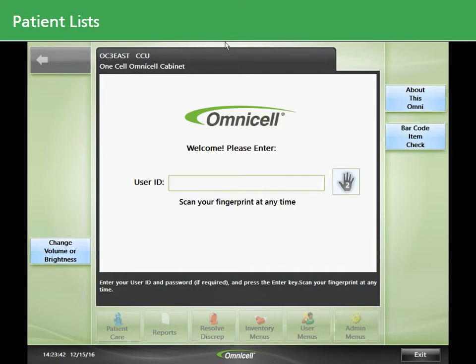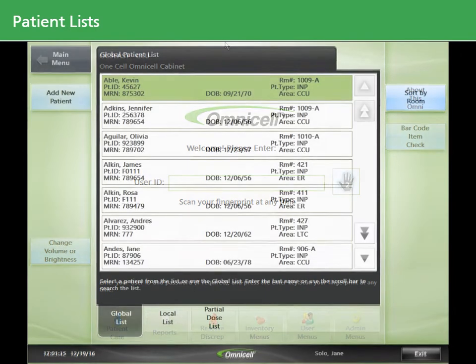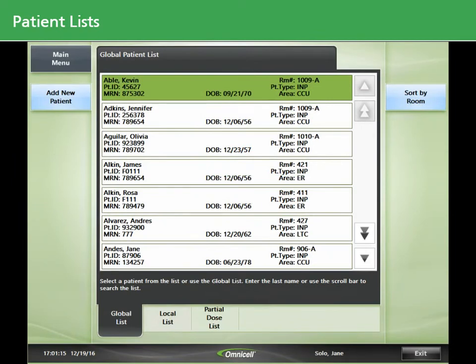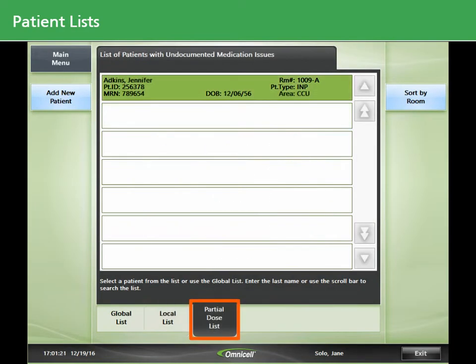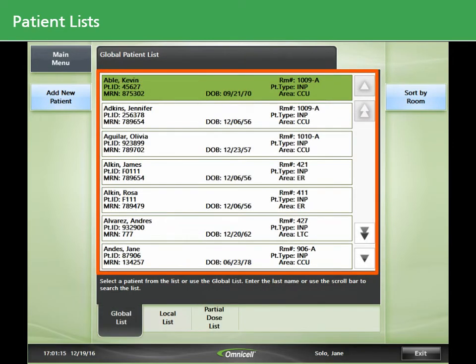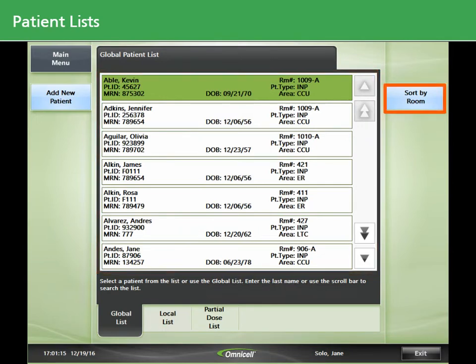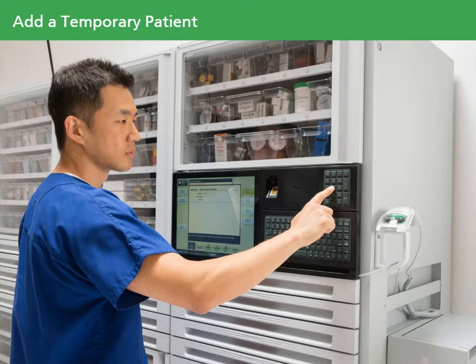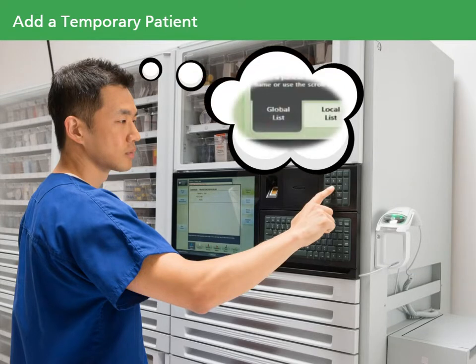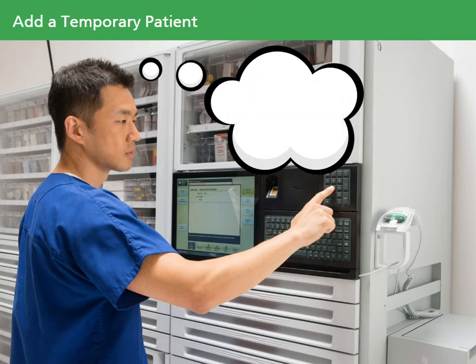Let's have a closer look at how to remove medications for your patients from the OmniCell cabinet. After you log on, you'll see a patient list. There are three types of patient lists: a global list that includes all patients, a local list that includes only patients in your work area, and a partial dose list that includes only patients with undocumented medication issues. All lists are arranged alphabetically by patient last name. The sort by room button allows you to sort patients by room.